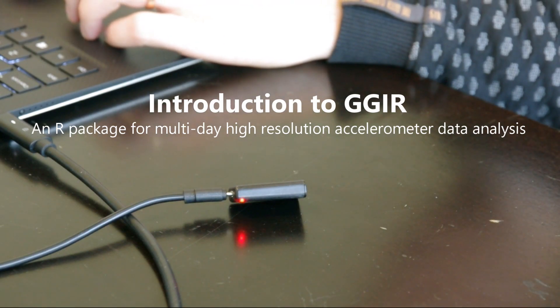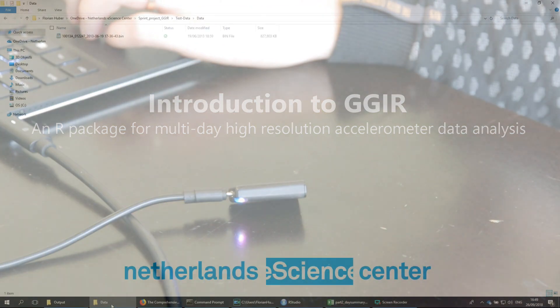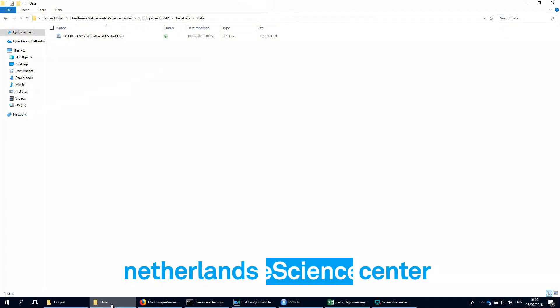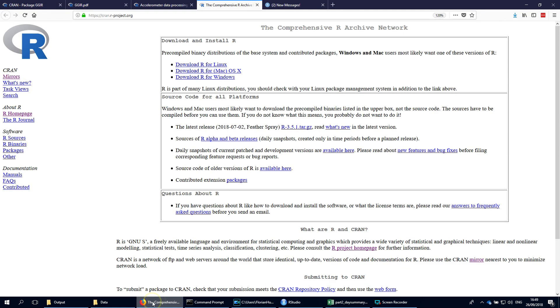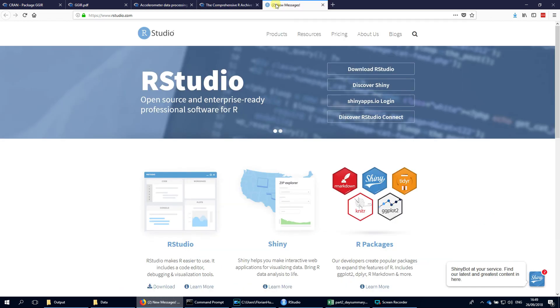In this video I will show you how R package GGIR is used. To get started we first have to download and install R and RStudio, which are freely available for Linux, Windows and Mac.